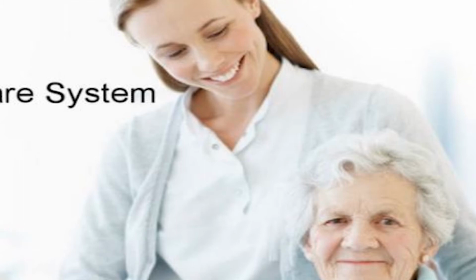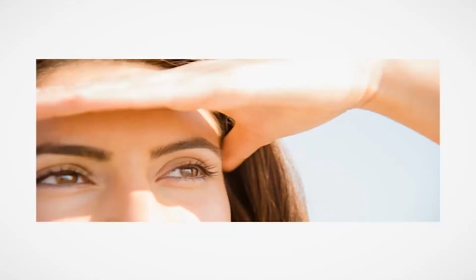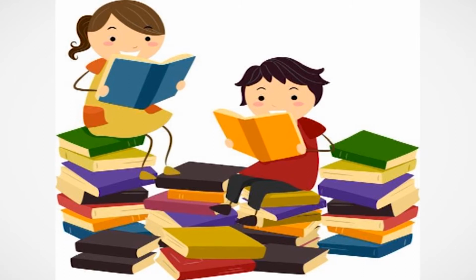Spectacle magnifiers have stronger and high-powered lenses compared to the usual eyeglasses and are designed for close work. The powers range up to plus 24 diopters. Spectacle magnifiers are used for tasks such as long term reading, writing, needlework, making invoices, and receipts. They are usually monocular with the weaker eye blanked out. The person using them needs to hold the reading material very close to their eyes in order to keep the print in focus. One needs some practice to get used to these spectacles.